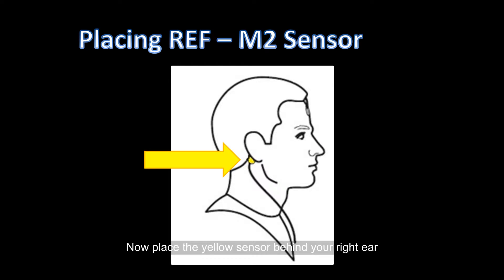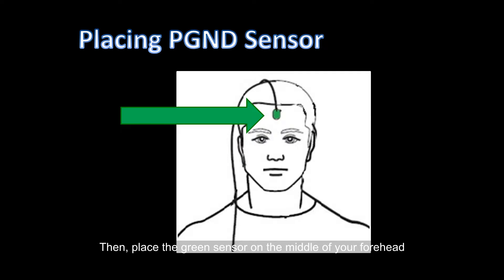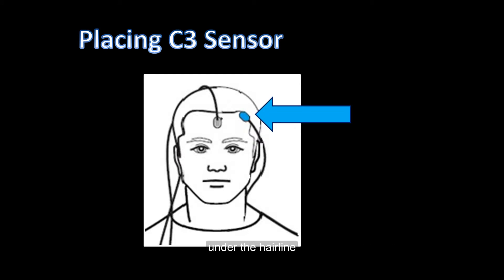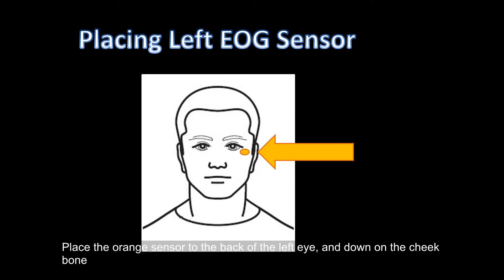Now place the yellow sensor behind your right ear. Then place the green sensor on the middle of your forehead. Next, place the blue sensor on the left forehead position above the middle of the eyebrow, under the hairline. Place the orange sensor to the back of the left eye and down on the cheekbone.